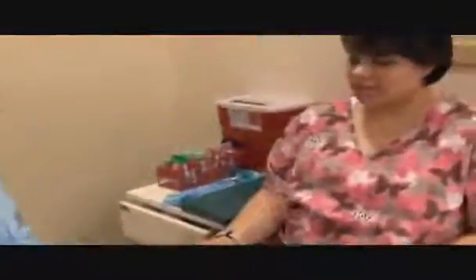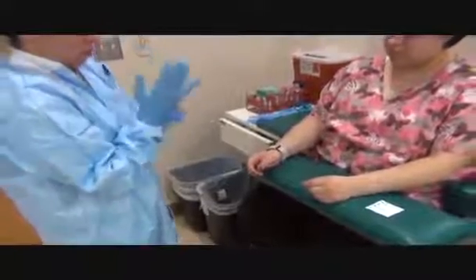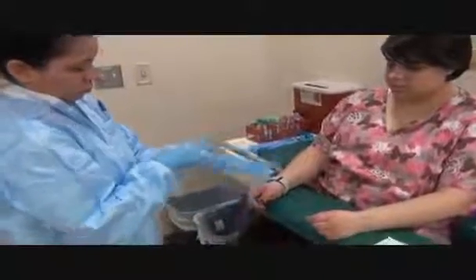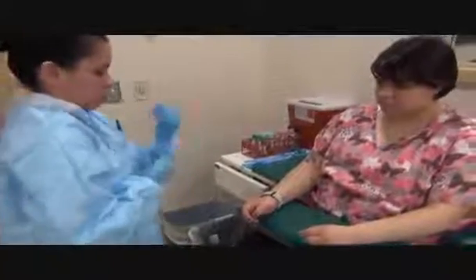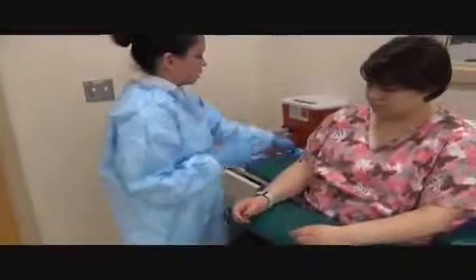Which arm do you prefer? Either one is fine. Okay, let's take a look at this one. You want to tie the tourniquet at least 4 inches above the site. Make a fist for me.